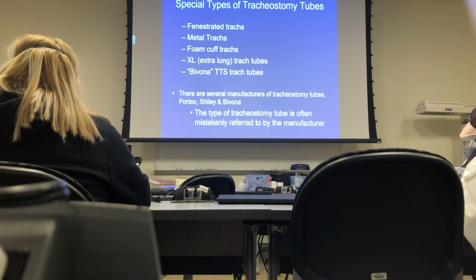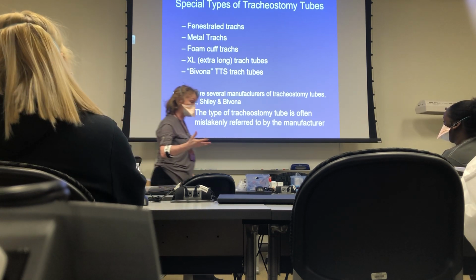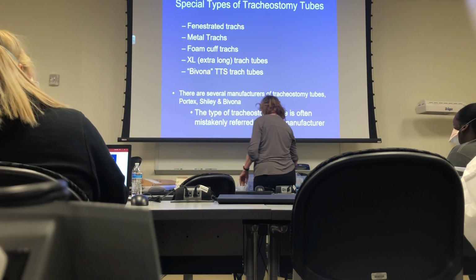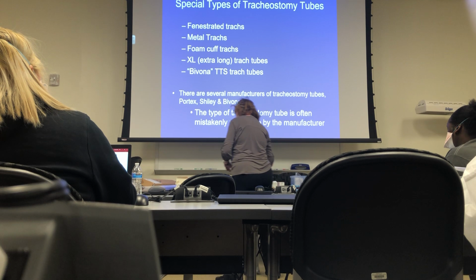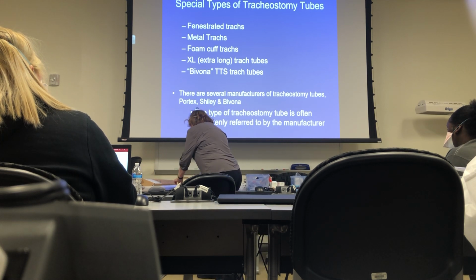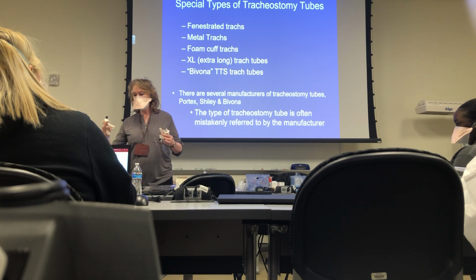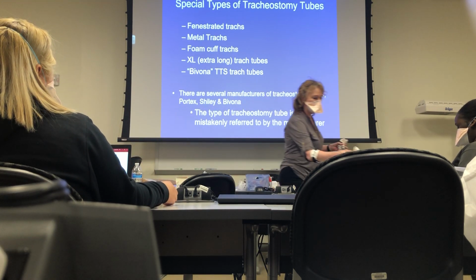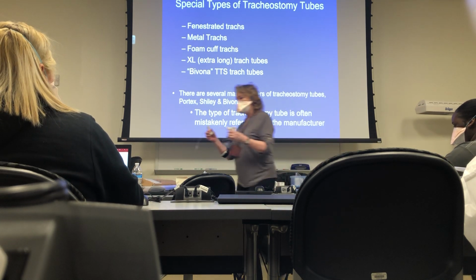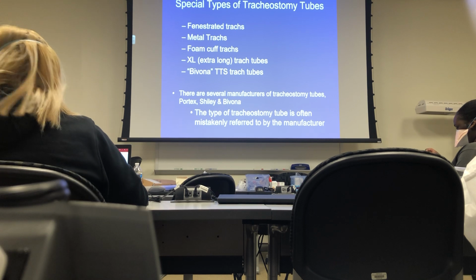All right, so now, those are Portex, Shiley's, regular trachs. There's a few special trachs that you guys need to know about. The first one is a fenestrated trach. All right, put your trachs back together with the inner cannula in them. I won't take the obturators yet. And then I want you to look at what is the difference between this trach and that trach.